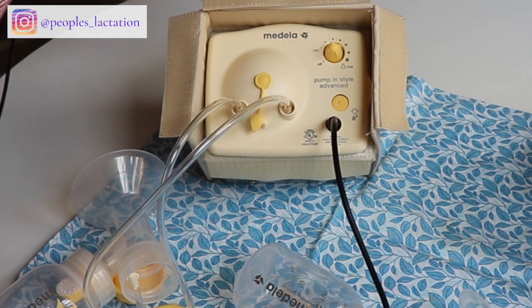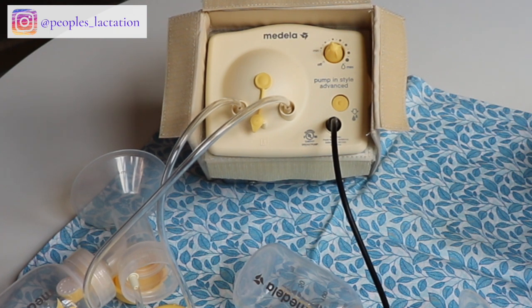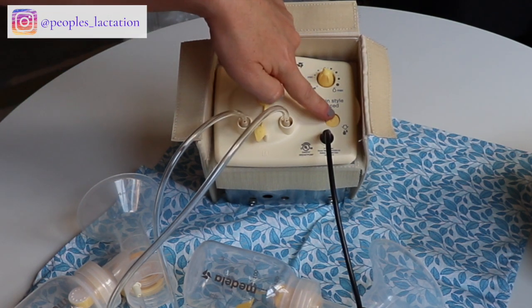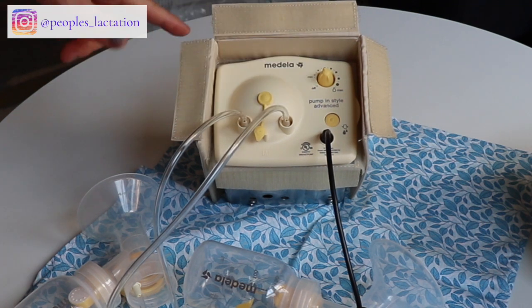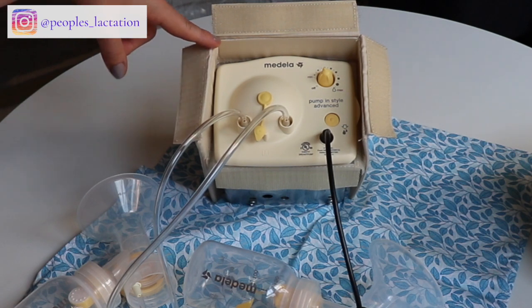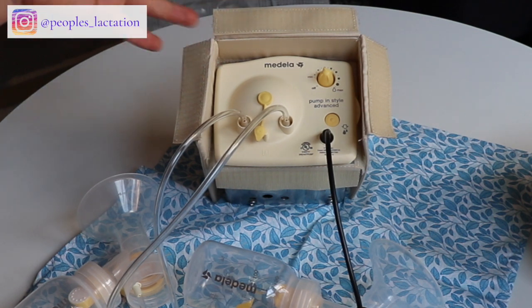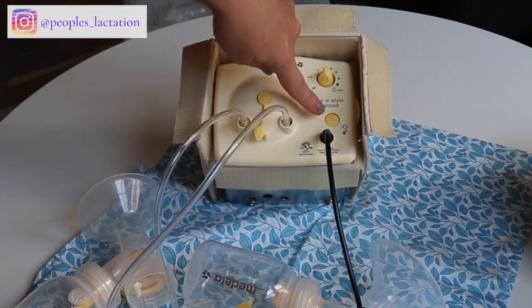You can play around with the suction and find what feels best to you. It is a little bit of a noisy pump. The pump will automatically switch into the expression phase after about two minutes, which has a little bit longer and stronger pulls. If two minutes feels too long and your milk lets down sooner, you can hit the yellow button to kick the pump over into the expression phase early. Also, if the milk flow starts to slow down around seven or eight minutes, you can hit this button again to initiate another letdown phase.